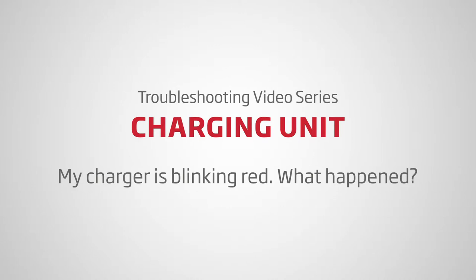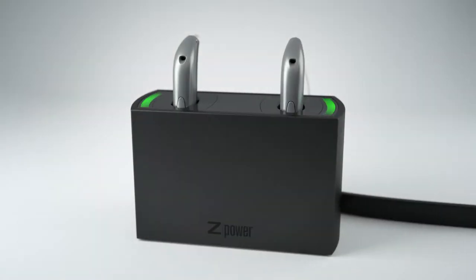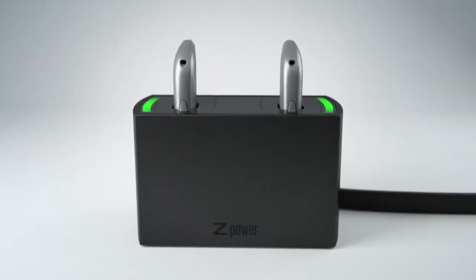Troubleshooting video series — charging unit. My charger is blinking red. What happened? Your battery charger uses lights to help indicate when the system is charging your hearing aids, as well as notify you if there's something wrong.